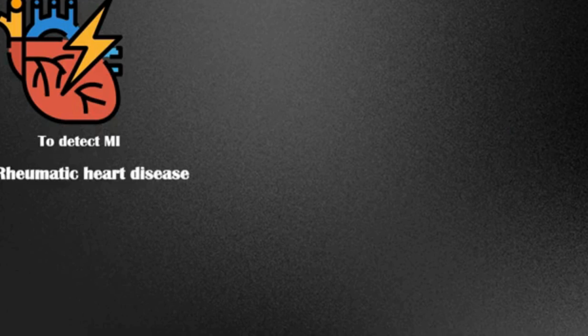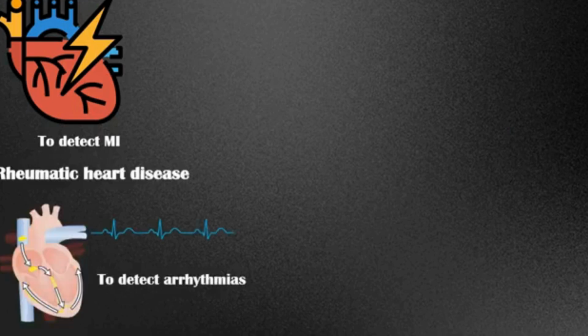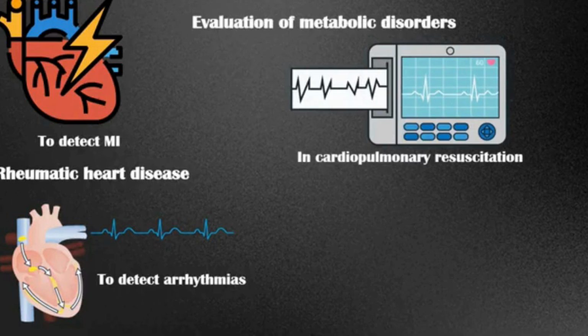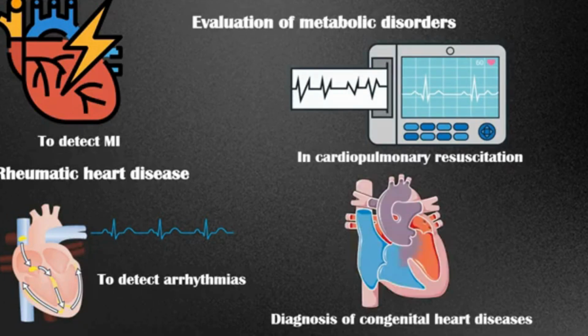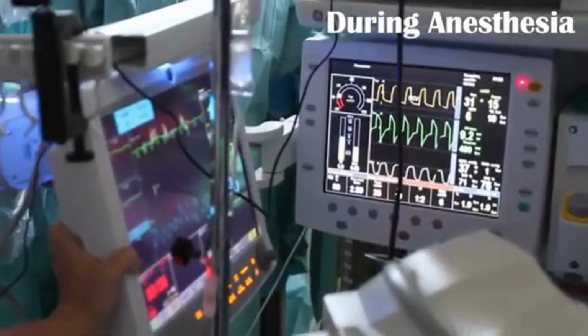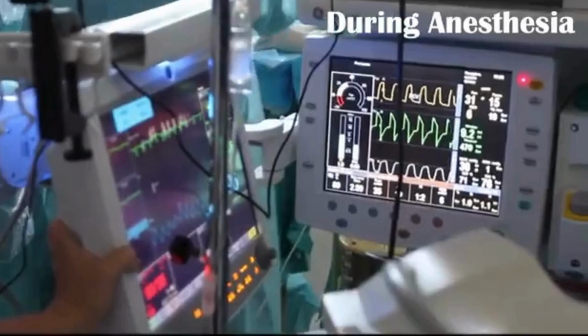Rheumatic heart disease. To detect arrhythmias and electrolyte imbalances. In the evaluation of metabolic disorders. In cardiopulmonary resuscitation. To facilitate the diagnosis of congenital heart diseases. And during anesthetic procedures for the continuous monitoring of cardiac function.